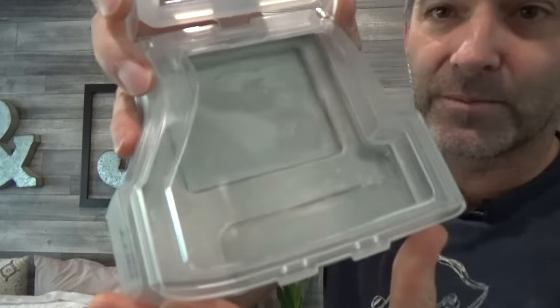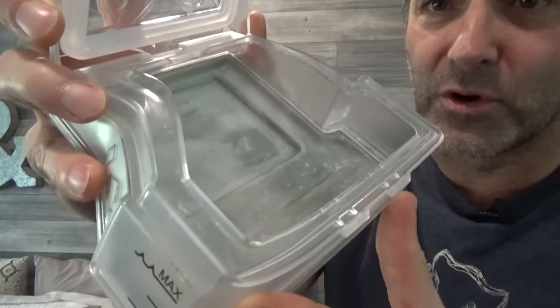Do you have to use distilled water in this? No, that's hella false. That's really false. Now this one right here, I did not use any of that. You can see the problem with it though. I don't know if you can pick that up. There's some mineral deposits in there. That's from the water being baked down and all those minerals are left in there. If you wash this out every morning, you empty it and you start with fresh water, that ain't gonna happen.